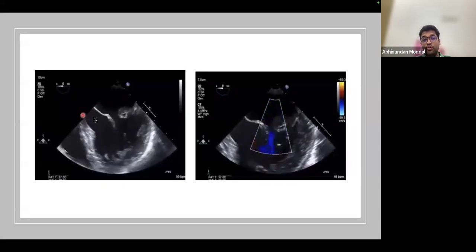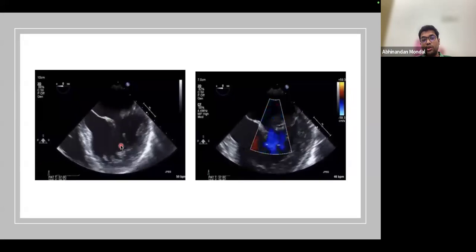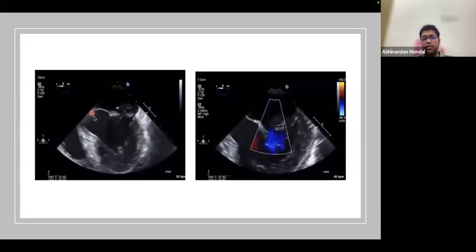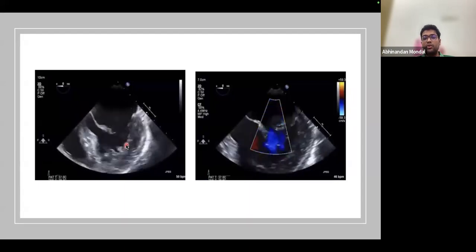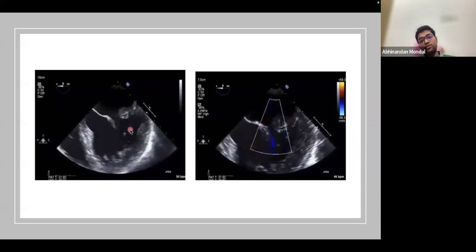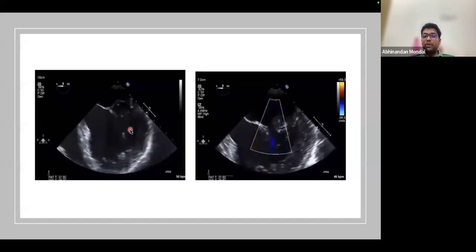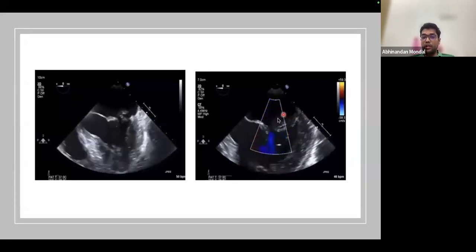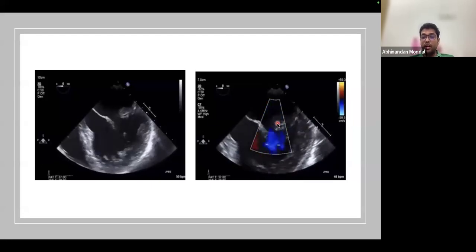So what is the view? We can see over here this is a LVOT, but we cannot see any aortic valve. So it is anywhere between your midesophageal 5 chamber and your 4 chamber. So it can be A2, P2 or it can also be A1, P1. So mainly P1 or P2 is your culprit. Put the color Doppler in the same image. You can see your eccentric jet.